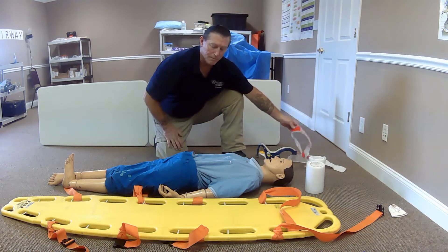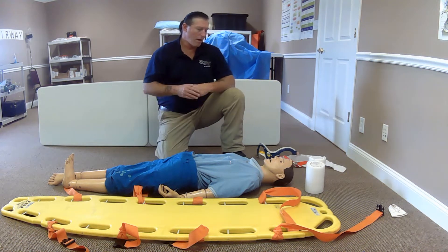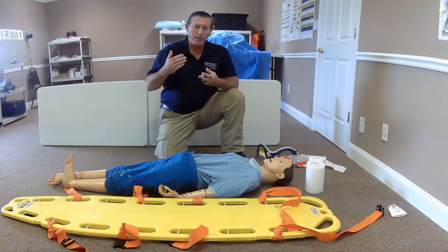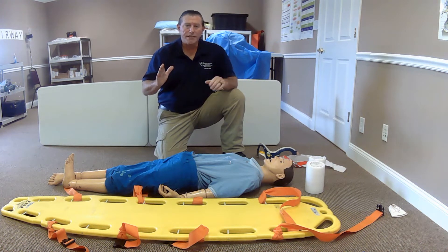We will simulate taping the head to the device for training purposes only. For this skill, I will have two additional EMS assistants with me. BSI, scene safe.